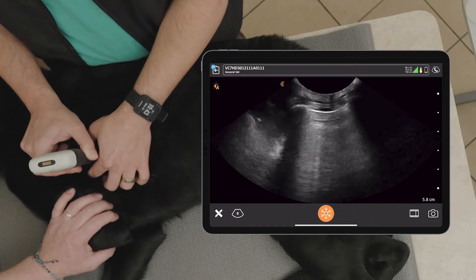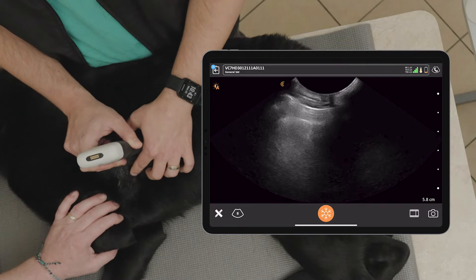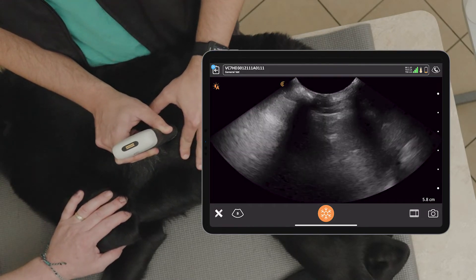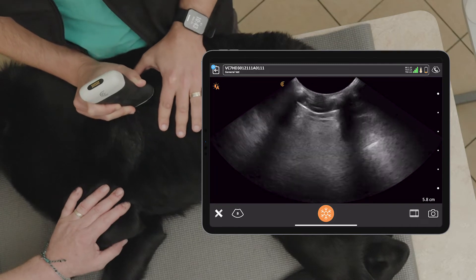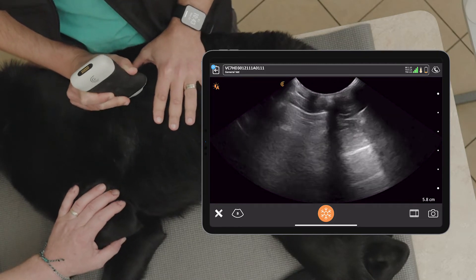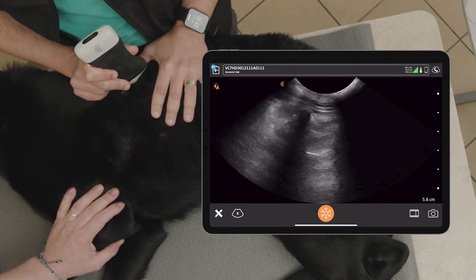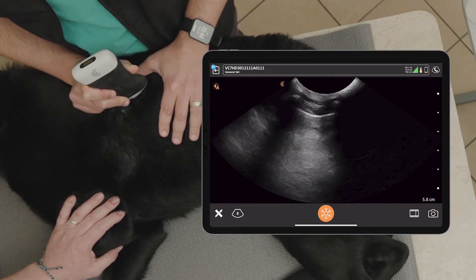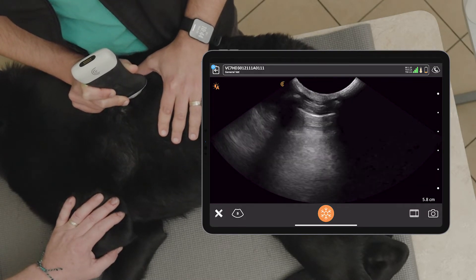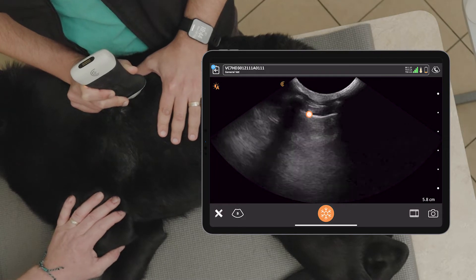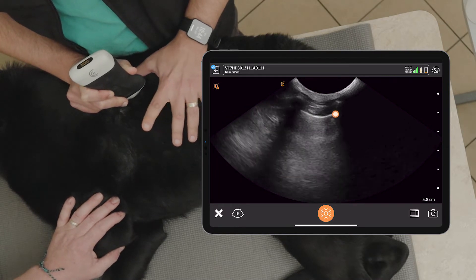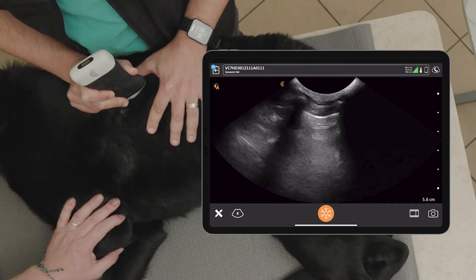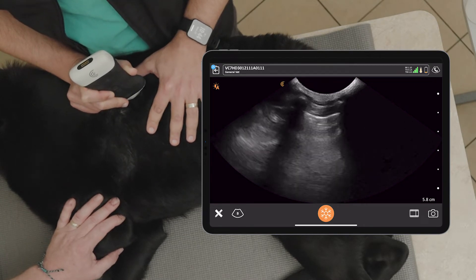So we're at that cranial border. We want to start at that caudal dorsal position. We're going to find that caudal border right there and slide all the way up until we lose the pleural line — we're in the epaxial muscles. Coming right back down to find that pleural line. Now I have found the pleural line and I'm ready to do my S-shape scanning. The key is I'm just looking at that pleural line and looking for changes there.